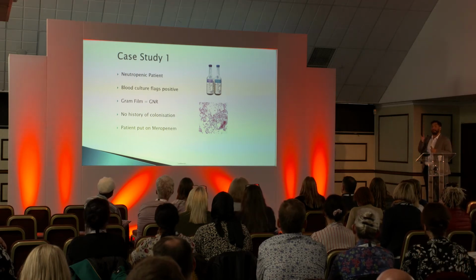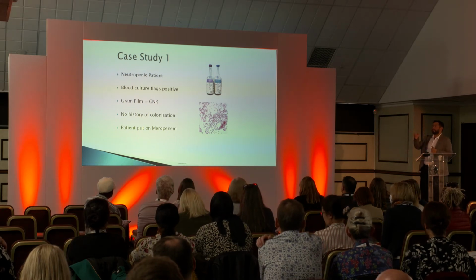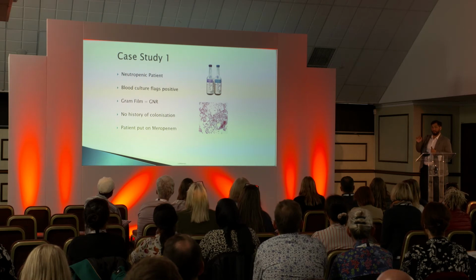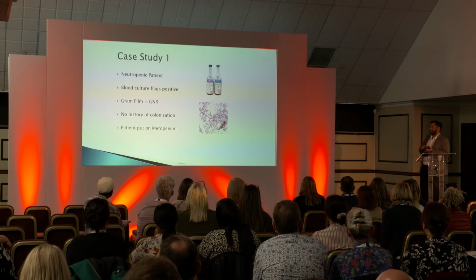So I'll look at how we would have done it previously, before MALDI had come in. In our old way, if the bottles had flagged up positive, we would have done a Gram film. In this Gram film, it's Gram-negative rods. So that could be a number of different organisms. It could be E. coli, Klebsiella, Pseudomonas.